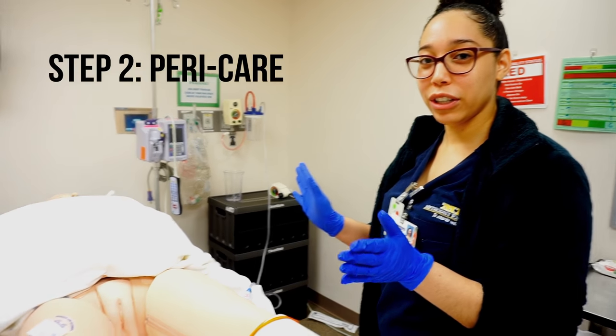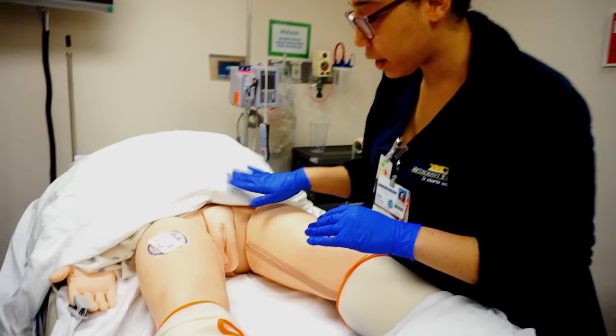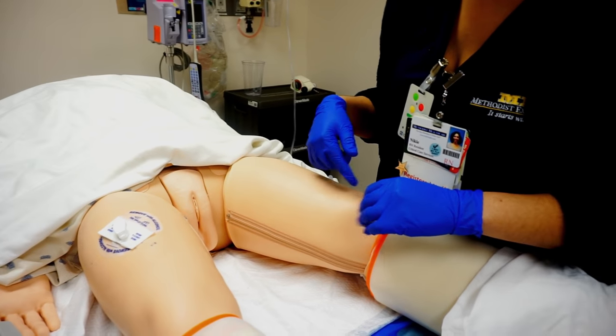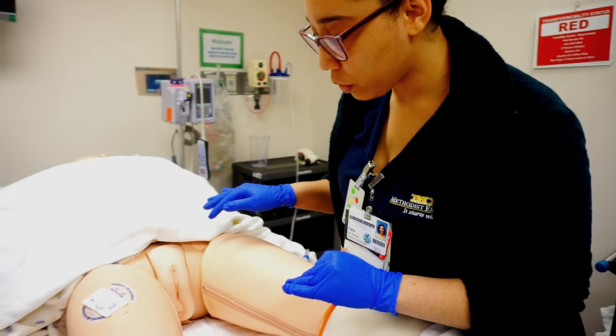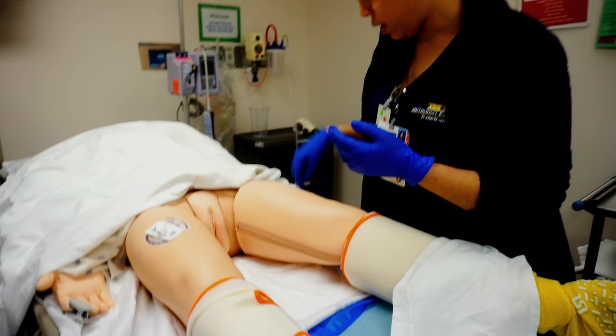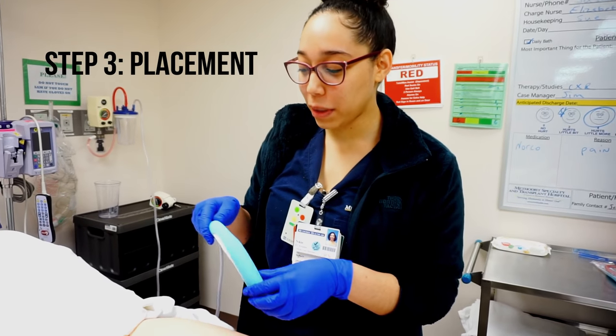After you perform hand hygiene and put on your gloves, you're going to perform peri care on the area. Assess to make sure there is no skin breakdown and no previous wounds. Make sure the patient is not having any diarrhea and is not on their menstrual cycle. Then you're ready to place your Purewick.